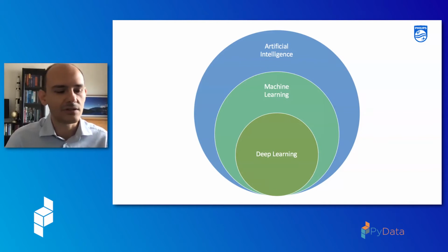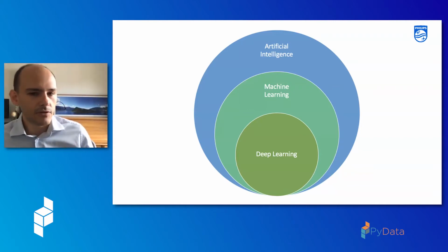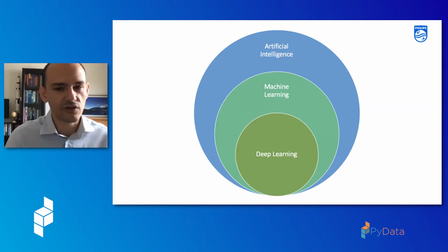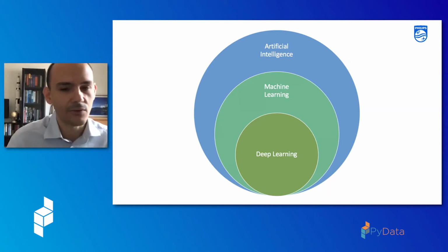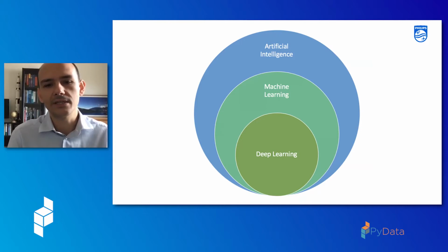Then another real bird's-eye view on artificial intelligence. We hear a lot about artificial intelligence these days, and it is nowadays covering so much. Basically, even advanced algorithms are called artificial intelligence. What I'm going to talk about is machine learning, which is a subset of artificial intelligence technology that really learns some specific functionality from data. So really data-driven learning, which is quite fitting for today, by the way. And within this superset of techniques, I'm going to talk about deep learning, which is one of the groundbreaking innovations of the last decade, where the machine learning technologies that learn from data are pushed to the limit by learning very rich representations.